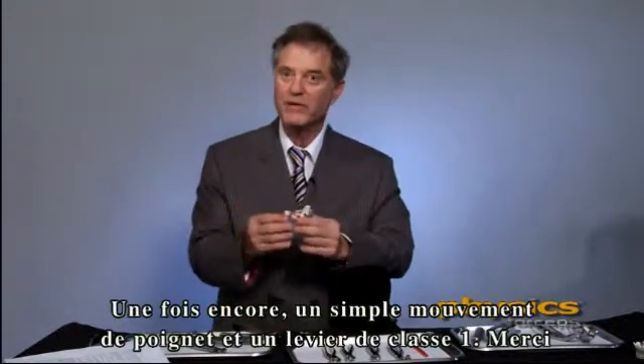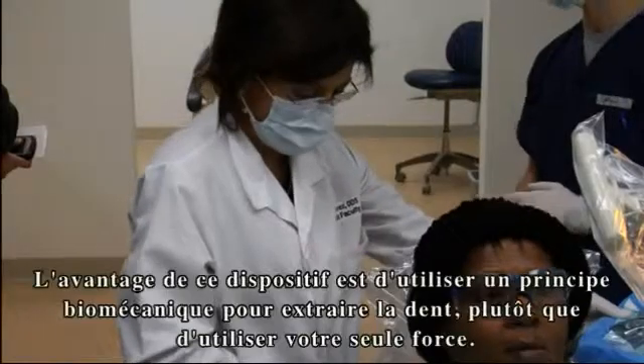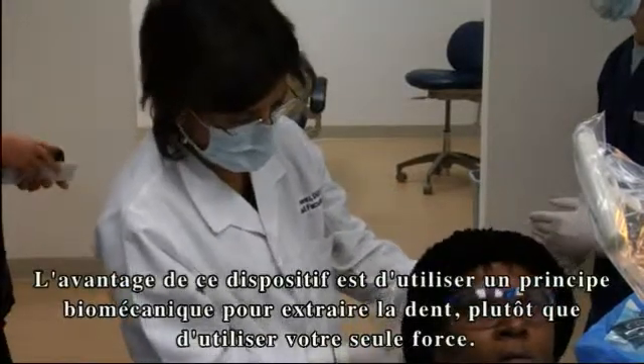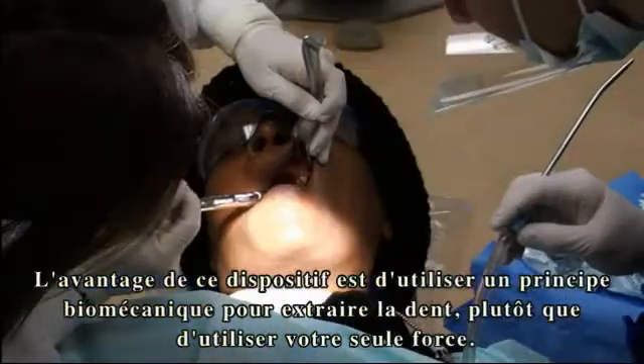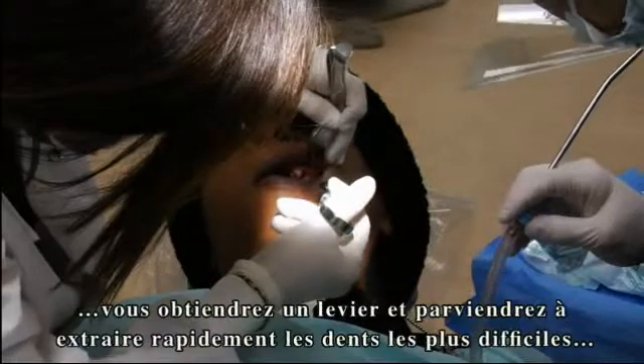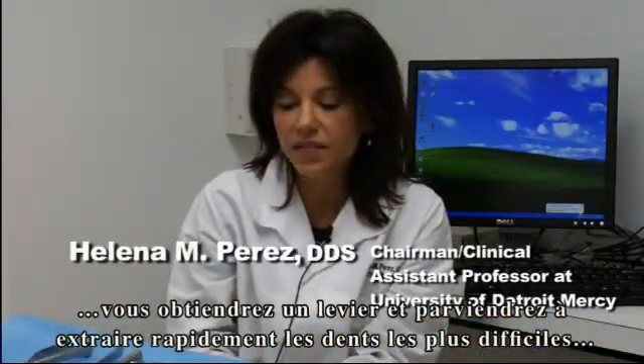Again, wrist movement, class one lever. Thank you. The advantage of these instruments is using a biomechanical advantage to take the teeth out rather than just your strength. It doesn't matter how strong you are — if the instrument is used properly, you get leverage and difficult extractions can be done very efficiently.